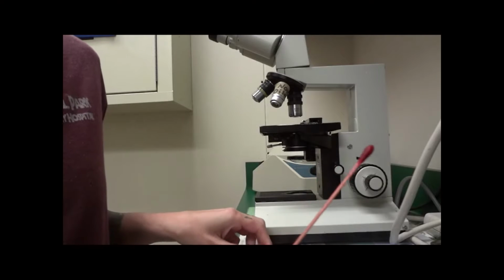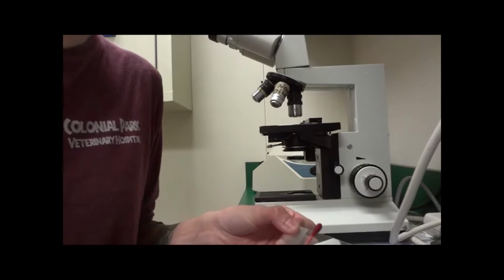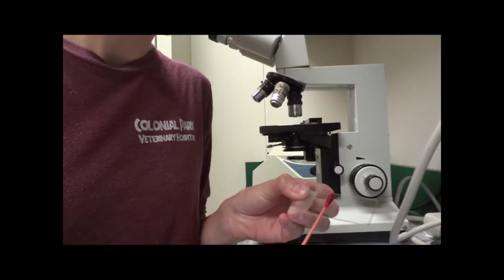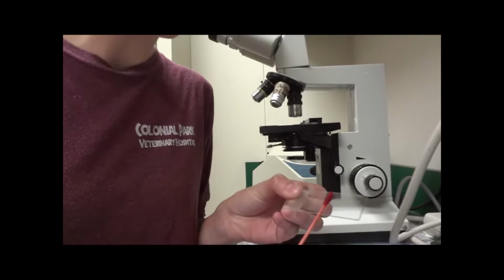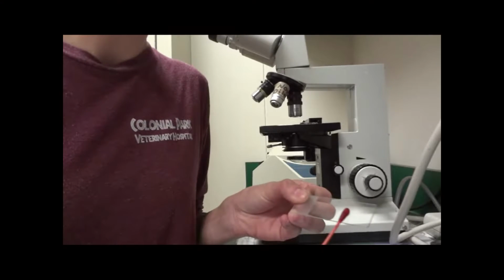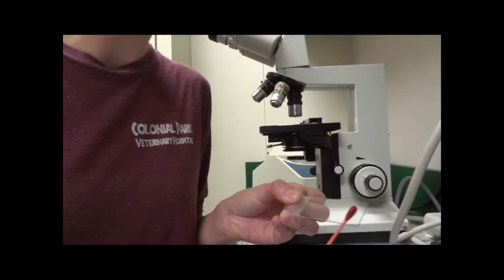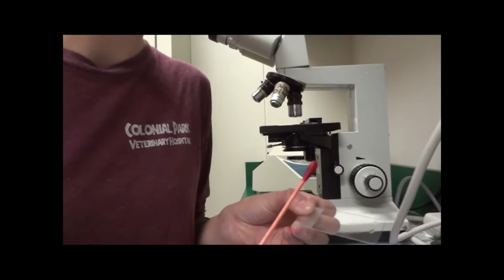Alright, now we will take the vaginal cytology swab and roll it onto our microscope slides. Being sure not to smudge it.